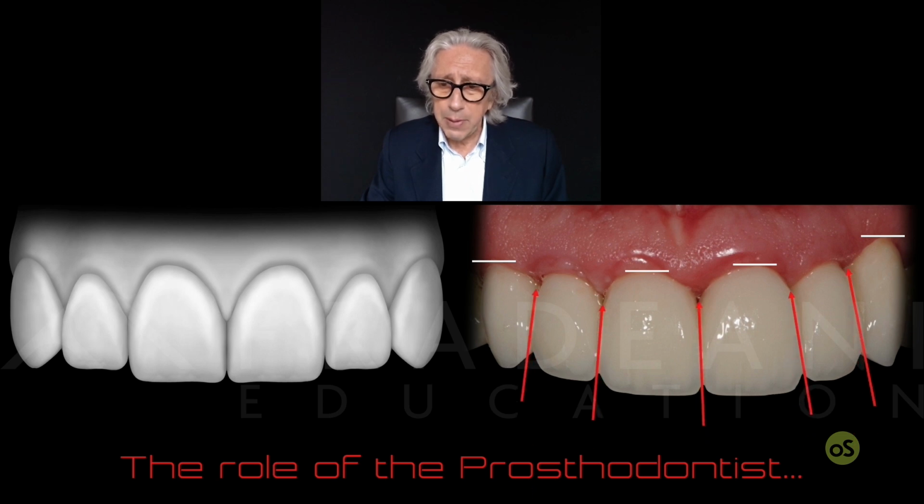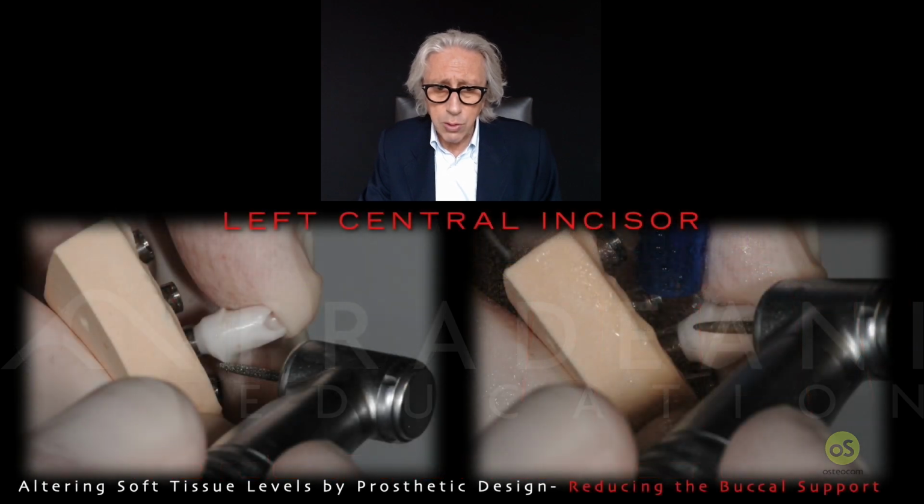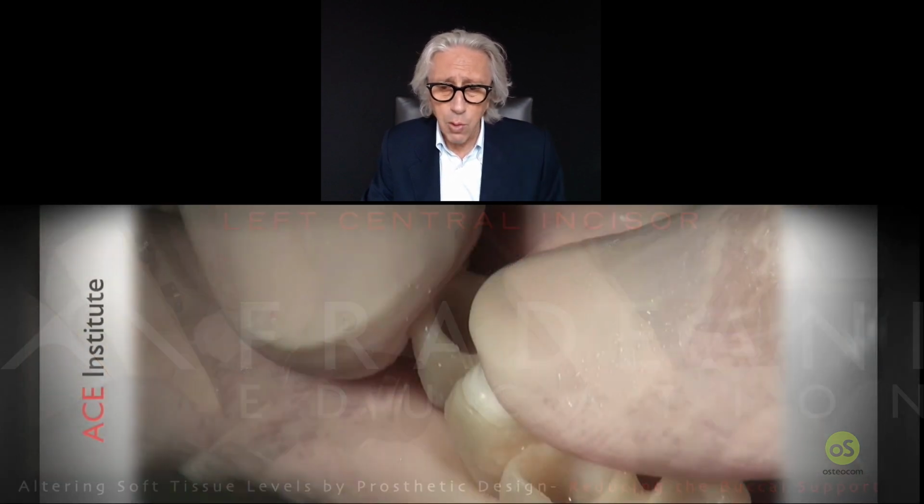What else? What about the papilla? Papilla were not good. They are very constricted. So you have to enlarge the space a little bit to facilitate some growing of the papilla. So we should increase the length there, decrease a tiny bit the central and more the cuspids. We did some modification, and you could see that again I can put my abutment in the model and still modify the line between abutment and root. Again, you cannot do that practically in the patient's mouth with a natural dentition.